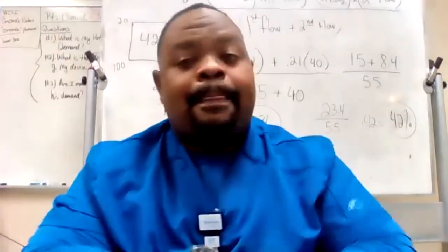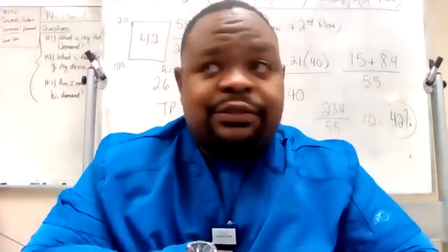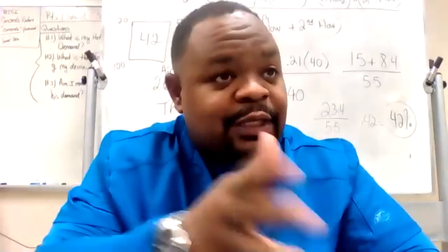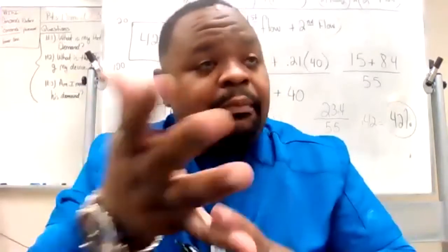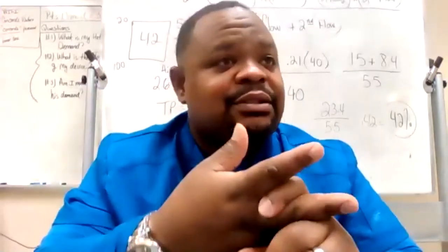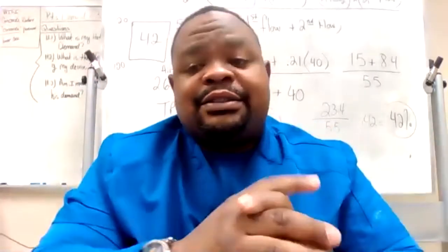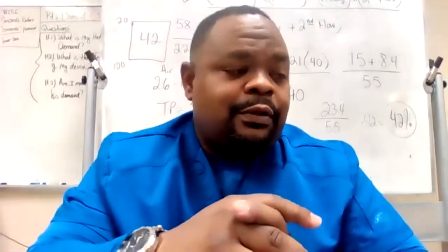That's an oxygen analyzer. It analyzes the amount of oxygen in the gas that's going. You don't know what kind of gas it is. It could be carbon monoxide, it could be helium, it could be oxygen, it could be room air. If you don't know, the oxygen analyzer will tell you, all right?